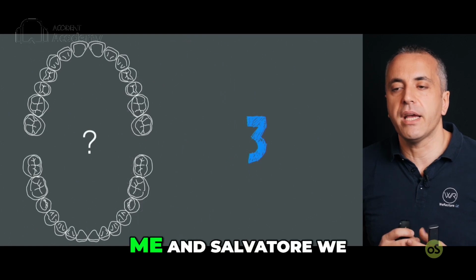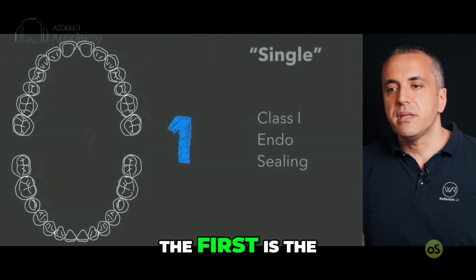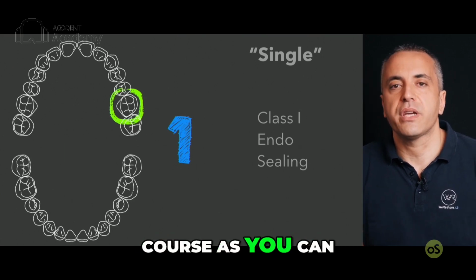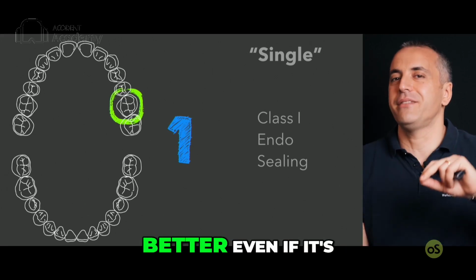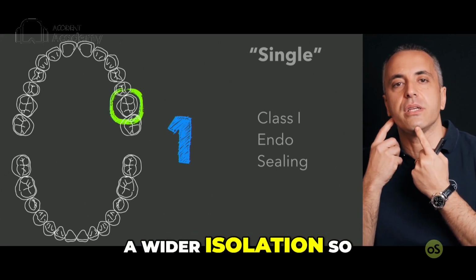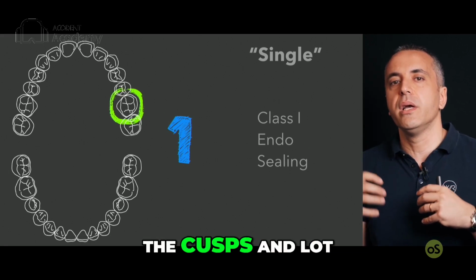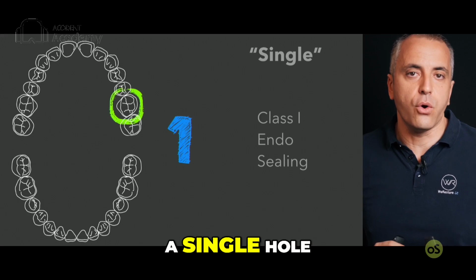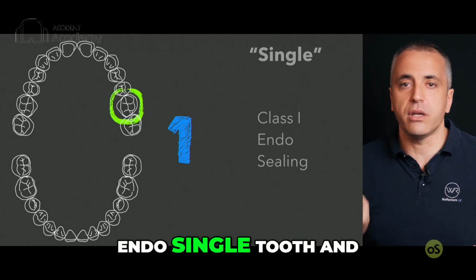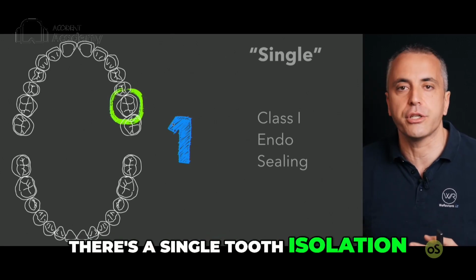Let's see. Me and Salvatore, we outlined just three isolation scenarios that we use every day. The first is the single tooth, which is quite simple, and as you can see on the right, is of course for class 1. We will see that sometimes it's better, even if it's class 1, to make a wider isolation so that you can see all the other surrounding teeth in order to understand the stiffness of the cusps and a lot of information. But at the beginning, you can start, of course, with a class 1 with a single hole. Then, of course, for endo, single tooth, and for sealings, sometimes you just want to seal one single tooth. So that's single tooth isolation.